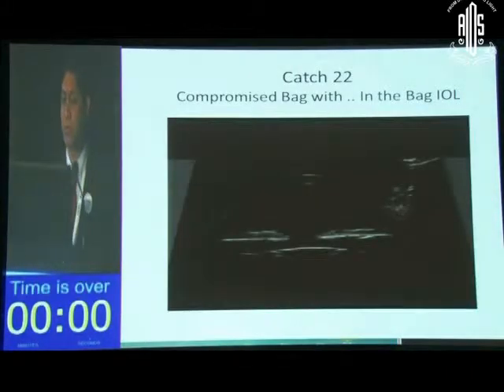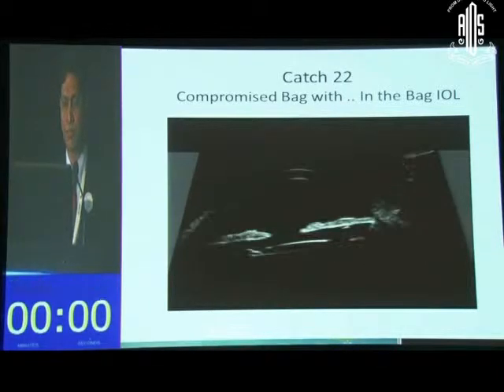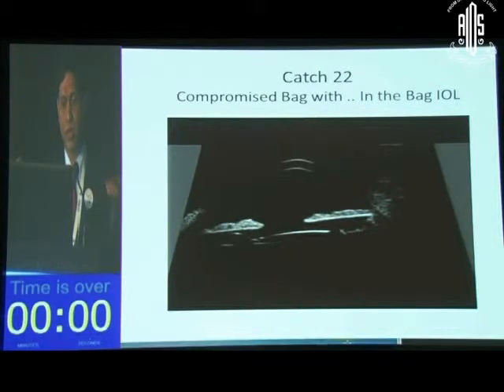We did a UBM to be sure, and you see the lens. There is a lot of clearance from the iris. The iris is not deformed, suggesting that the haptics are not touching the back of the iris. Pigment dispersion glaucoma is very rare in the Indian population, and these situations can be forgiving, though there is not much published literature. I've done a few such lenses where a single piece IOL can be kept in the sulcus as long as it's fixated.